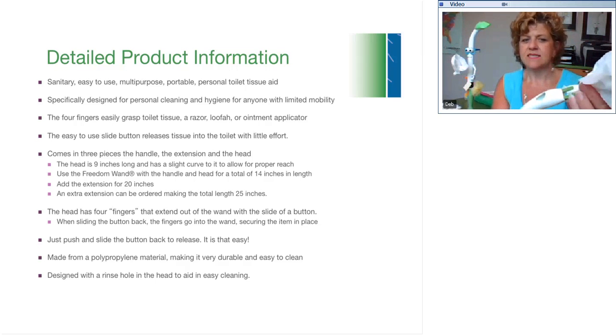Now, if that tissue only gets into the tip of those fingers and you wipe, it's going to come right off. If you don't make the pom-pom thin enough and this point thin enough, it's like putting a ball in a square peg and you can't pull it in.